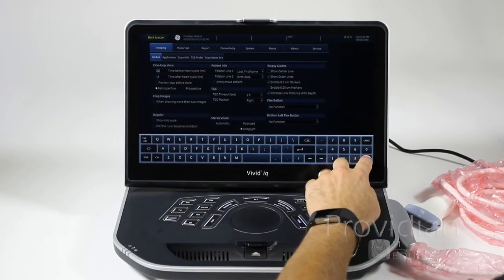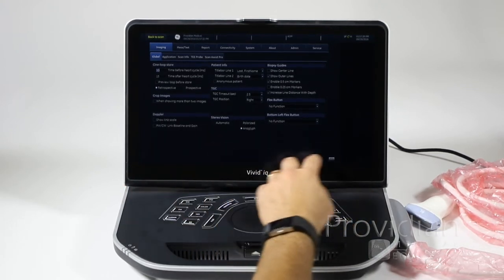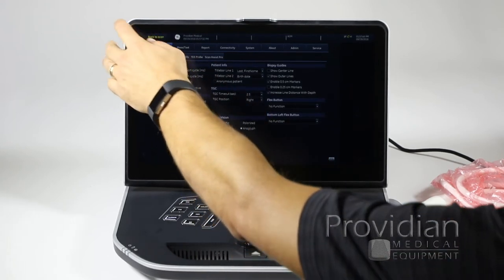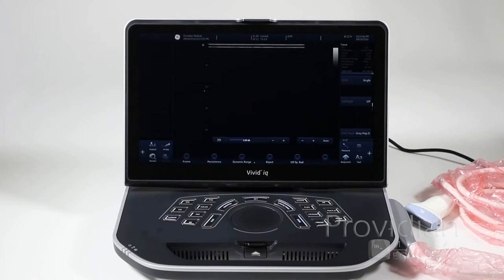That took me to the setup screen, so let me get out of that and get back to scan. Now you have your regular scanning screen, and technically you're ready to go. So let's do a quick tour of how this system works.